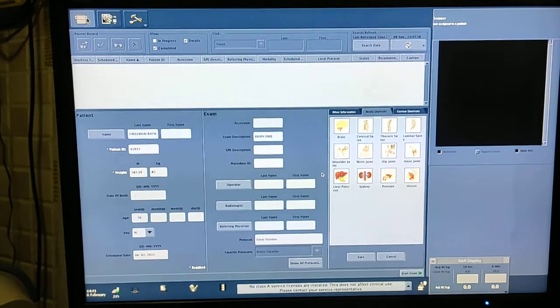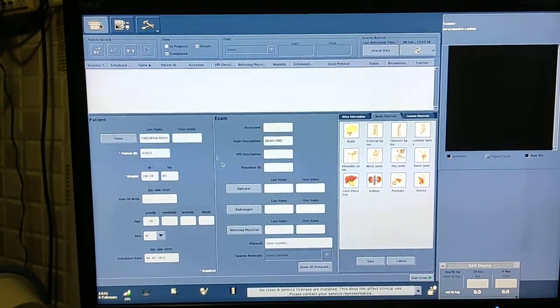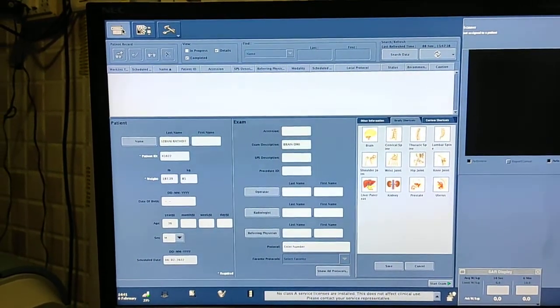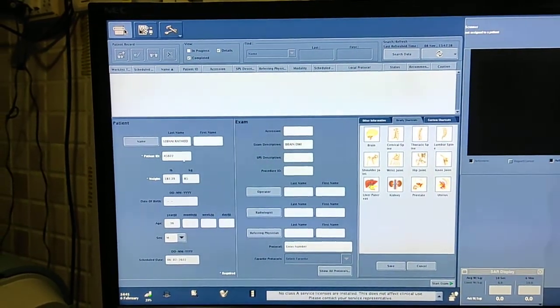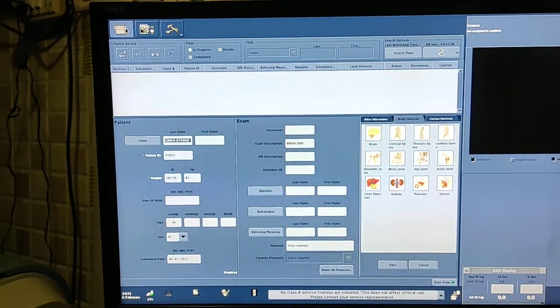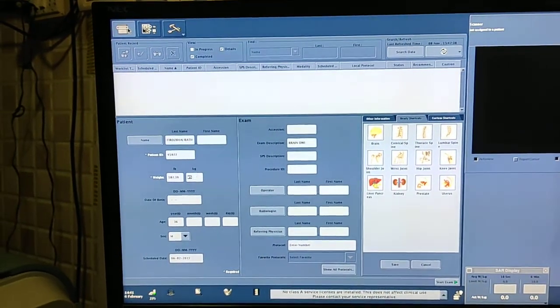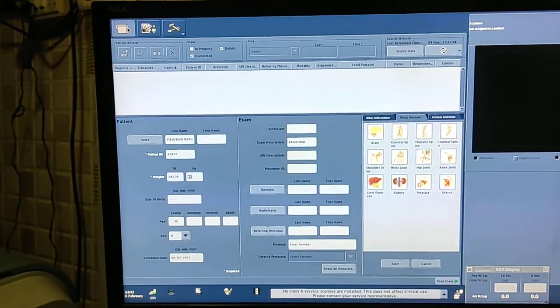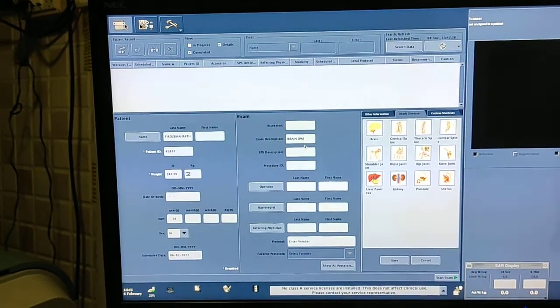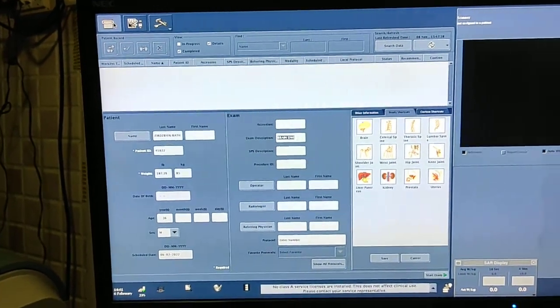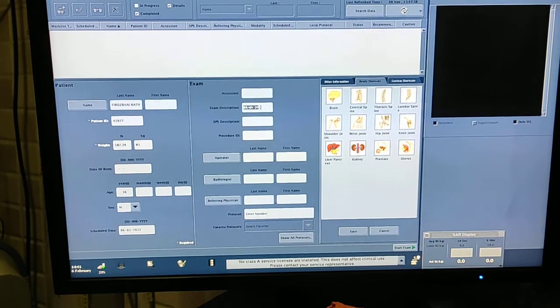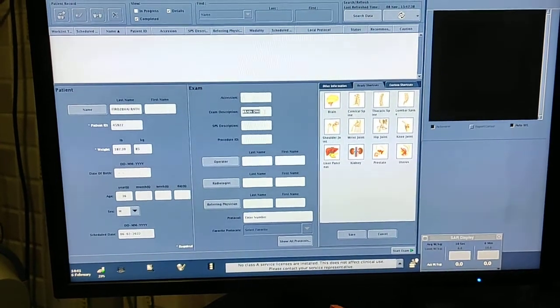I am at the entry desk. First of all you have to enter the data: patient ID, patient name, weight of the patient, age, sex, and description — write down whatever scan you are doing.